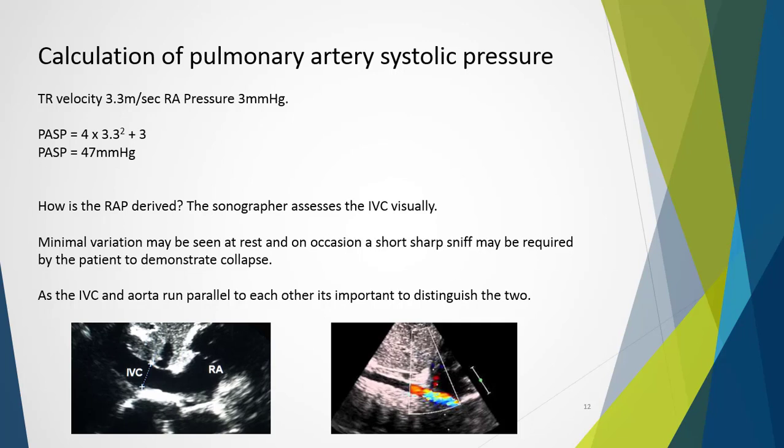Minimal variation may be seen at rest. On occasion, a short sharp sniff is required by the patient to exaggerate the effect and demonstrate more obvious collapse. As the IVC and aorta run parallel to each other, it is important to distinguish the two: the aorta is medially positioned, pulsatile, and not affected by respiration. Applying colour Doppler to the subcostal window shows red flow — blood moving toward the probe. The IVC is slightly laterally positioned, less pulsatile, may have respiratory variation, and shows blue flow — blood moving away from the probe toward the heart.